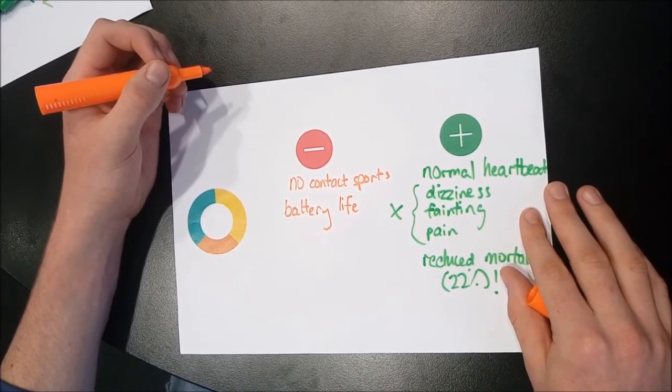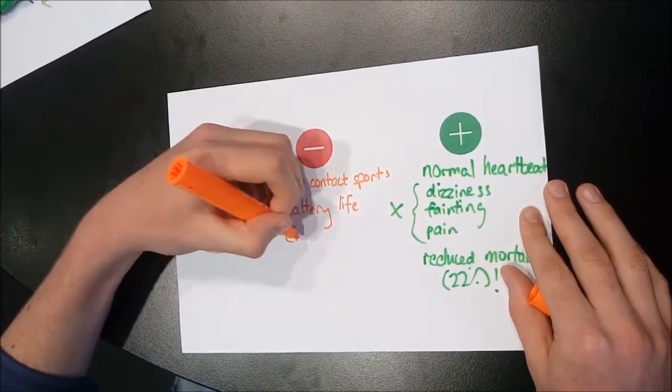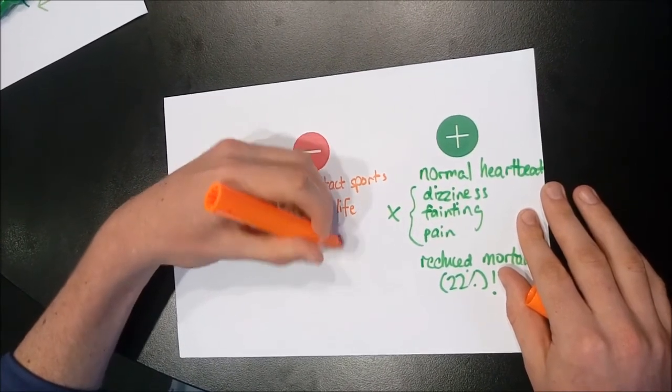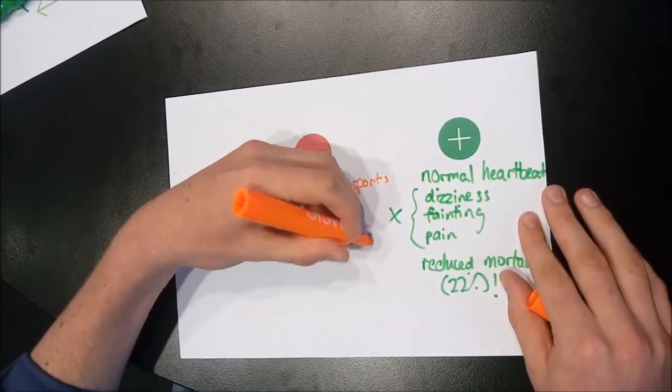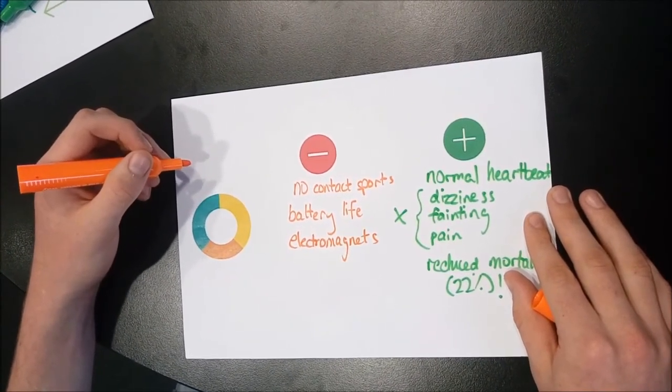Lastly, patients with pacemakers have limitations with respect to their exposure to magnetic and electromagnetic fields. Household appliances such as microwaves should have minimal contact with these patients. I will now pass to Ingenul to discuss the future developments and how these may overcome the current limitations.